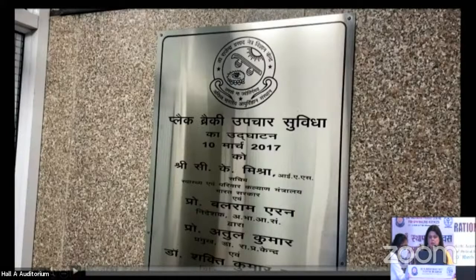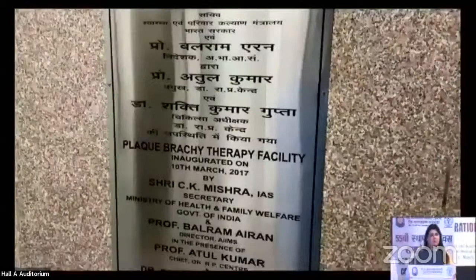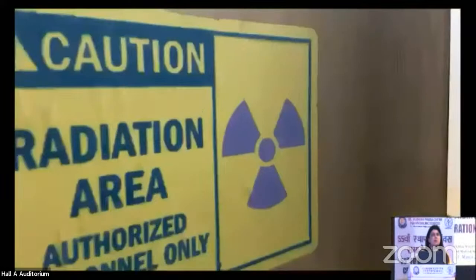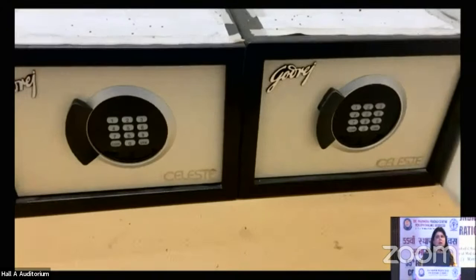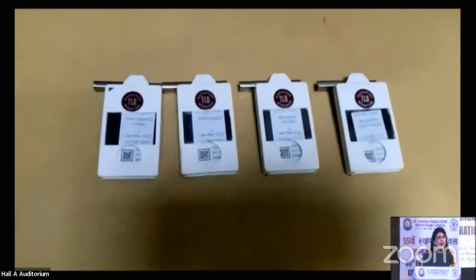As you know, we have a separate dedicated OT for the plaque brachytherapy facility because this is a radioactive source. And here you can see how the source is kept in the OT under strict supervision of our team from IRCH, the radiation safety officer who manages this aspect of the plaque. This is how the plaques are kept in our OT. These are the badges which all of us have to wear.